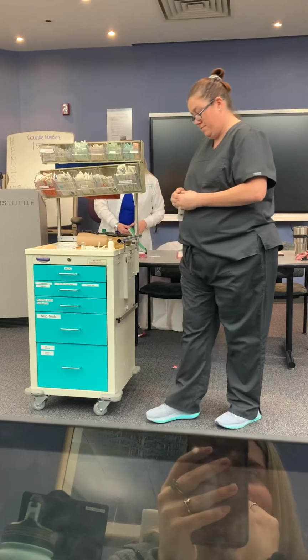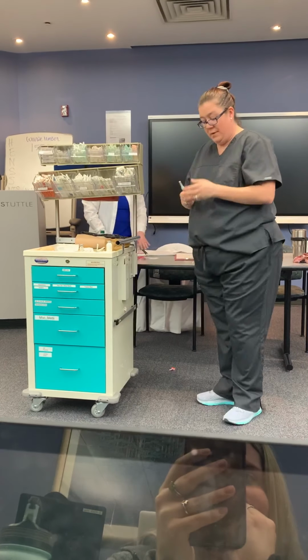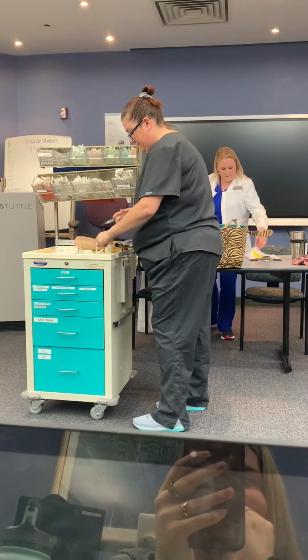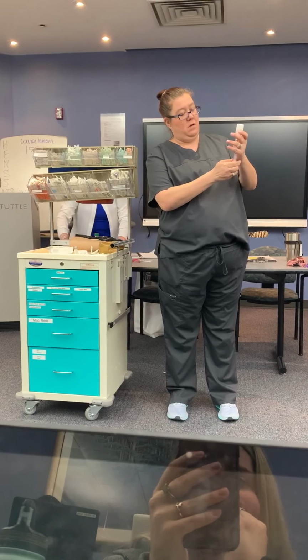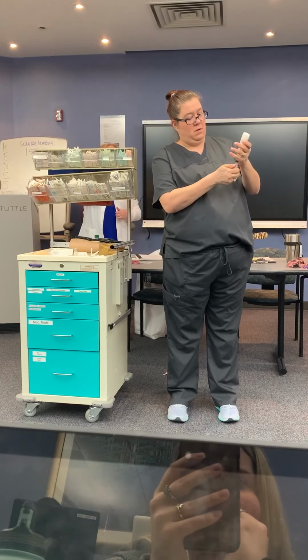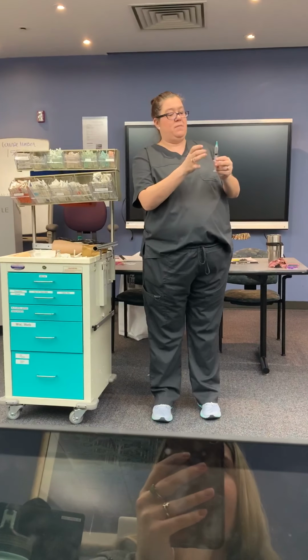Need a bigger syringe. So I've got my air. My 3.6 with some air bubbles.